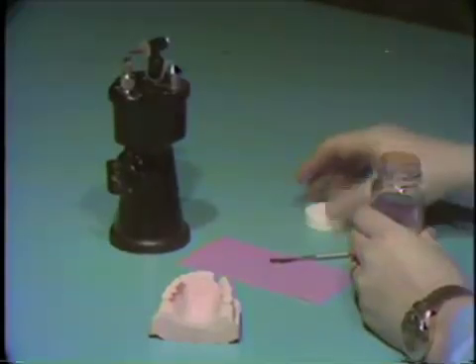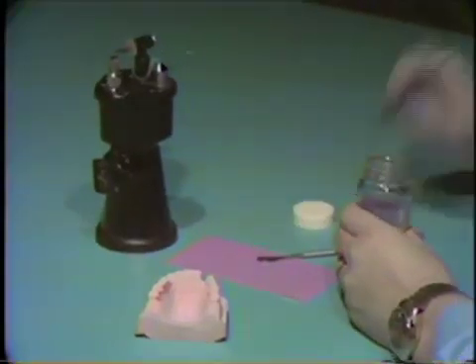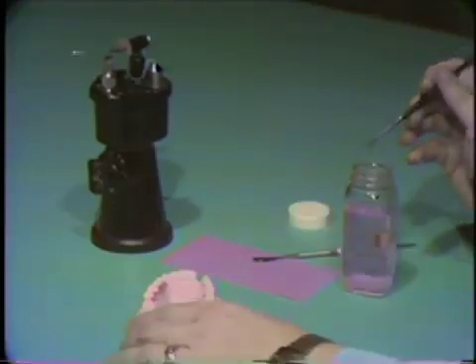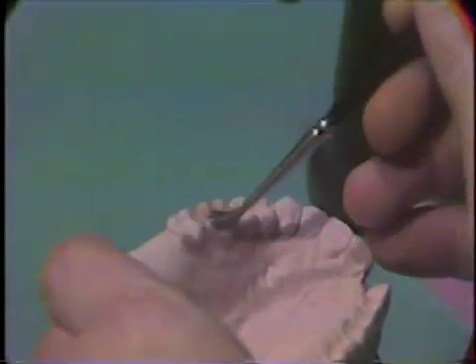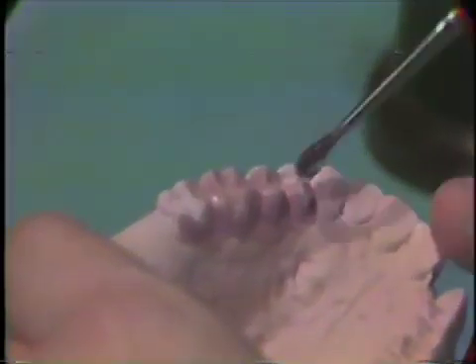The lingual undercuts should be blocked out in the same way. Apply a tin foil substitute, such as Alcote or Cosep, with a good sized brush over the cast in this area. The lubricant should cover the teeth, wax, and the gingival and palatal areas of the cast. Apply this coating liberally and allow it to dry.